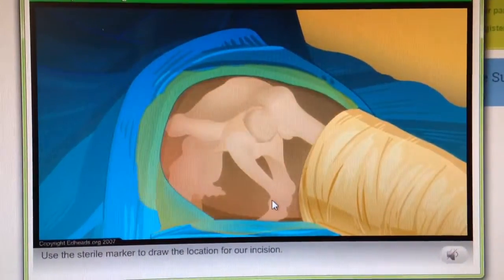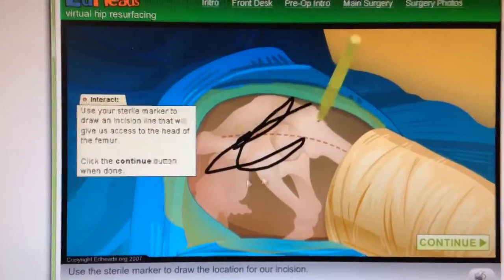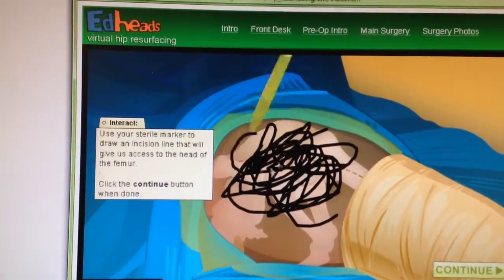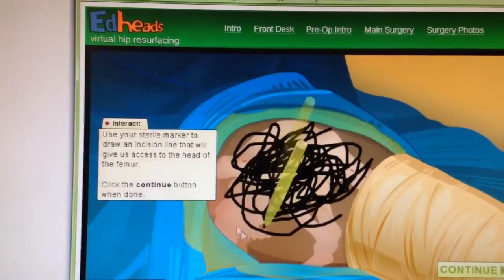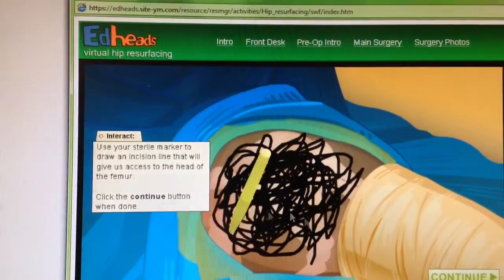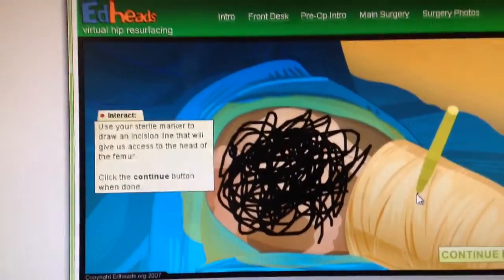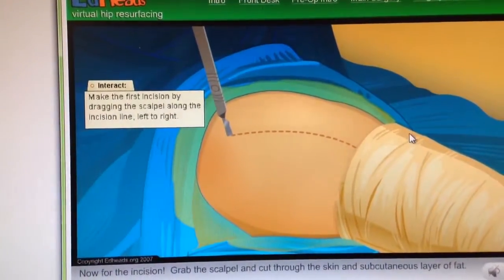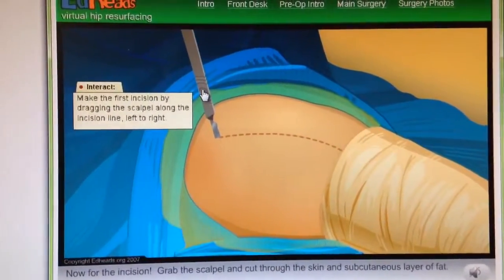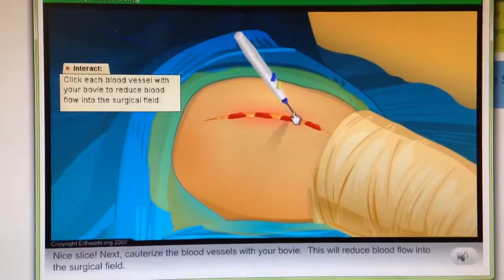Use the sterile marker to draw the location for our incision. Now for the incision — grab the scalpel and cut through the skin and subcutaneous layer of fat. Nice slice. Next, cauterize the blood vessels with your bovie. This will reduce blood flow into the surgical field.